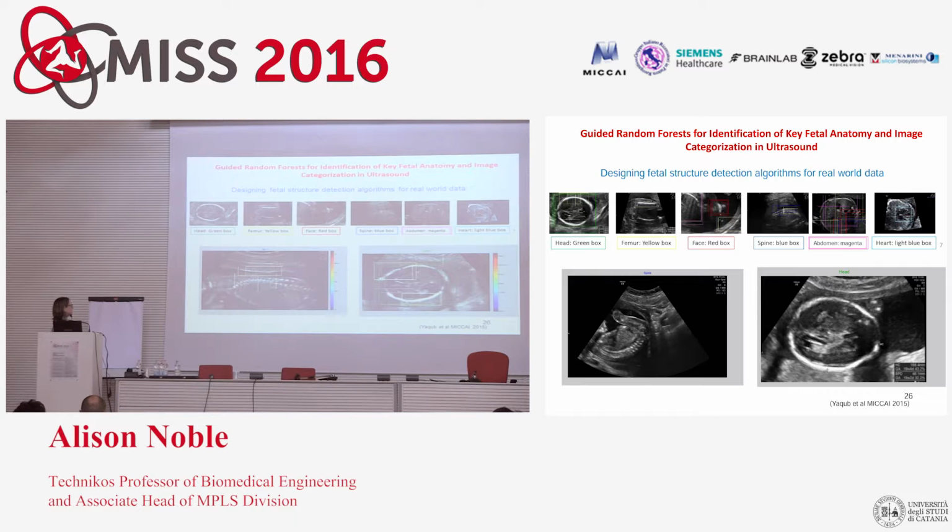Most of these will involve using recent machine learning algorithms, and I'm not going to go through the details. If you're interested in those, you can look at our website, and I've put the references on the slide as well. This is an example of using random forests, published at MICCAI 2015. The goal here was to design a method that could annotate typical ultrasound images that would be acquired for biometry measurement.